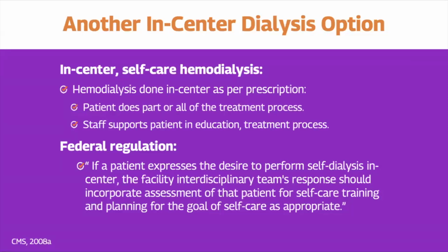With this option, the patient performs part or all of the treatment process in the dialysis center. This is unusual in the United States, but it is popular in Europe and Australia, especially for patients whose homes are not suitable for dialysis or who need some staff support. The nurses and staff act as educators and provide a support system.